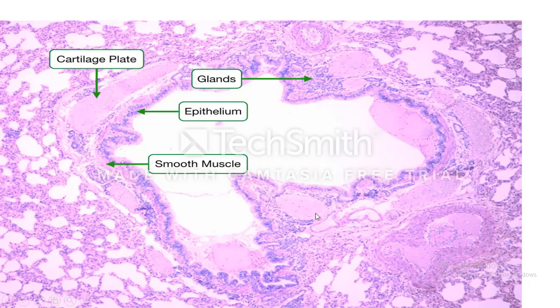This is a light microscope picture of the bronchus. Bronchus consists of mucosa, submucosa, adventitia. This is a cartilage plate, a cutting. This is the cartilage plate cutting here. This is the bronchus, similar to the trachea, but in this part it has a different structure. Why? Please say.